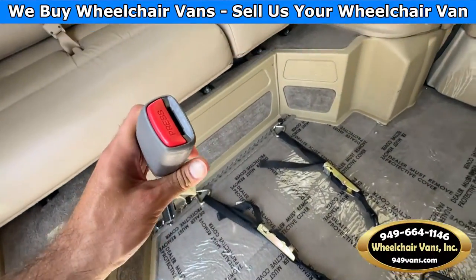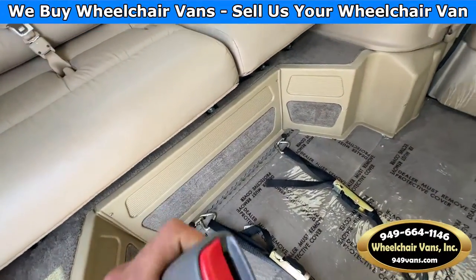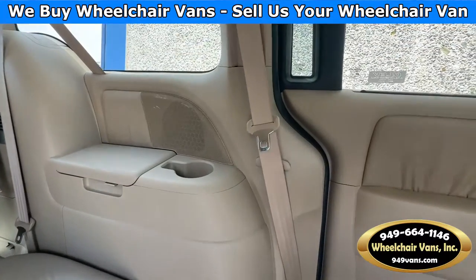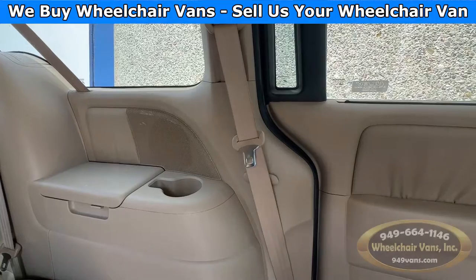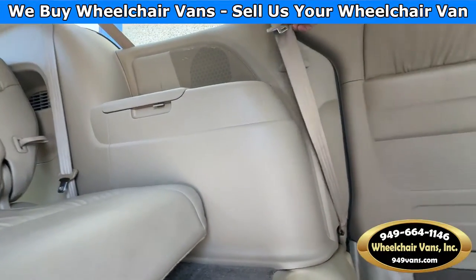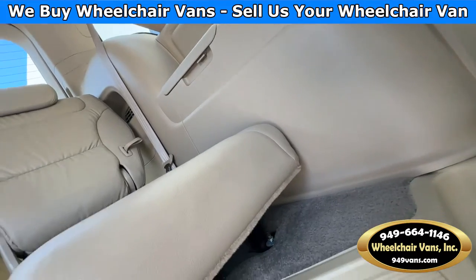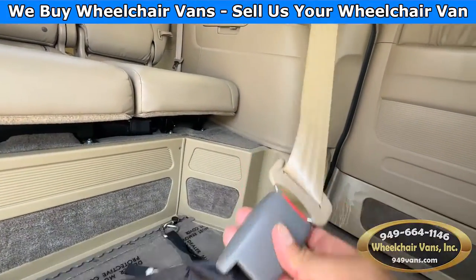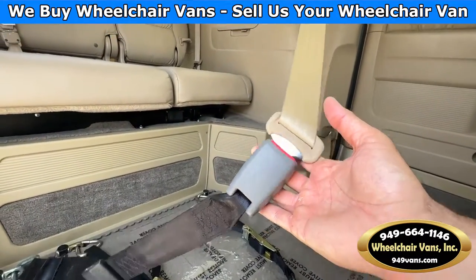For your seat belt, you will use this buckle on the floor here, and you can use this original seat belt from Honda. The way this works is you will buckle it in like so, and of course this can come out like this.